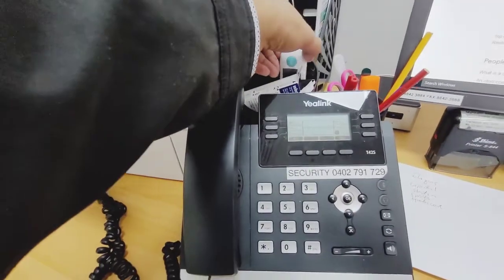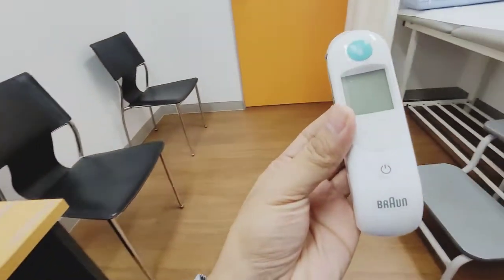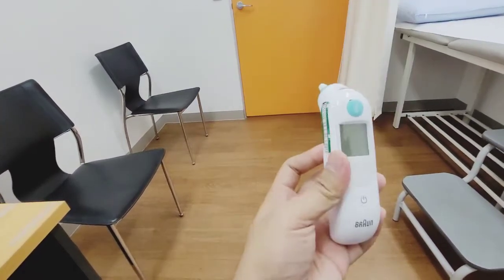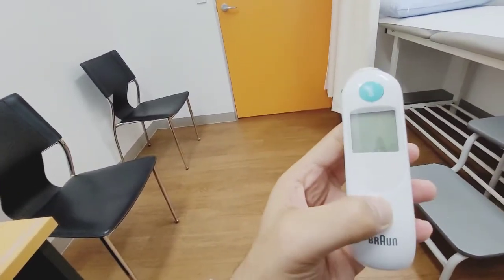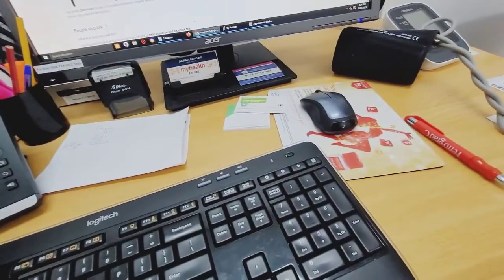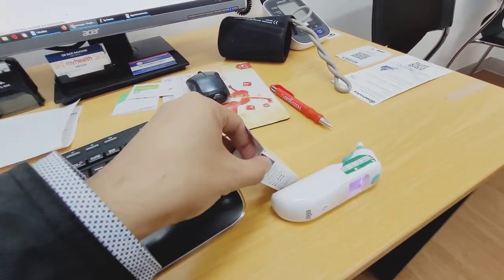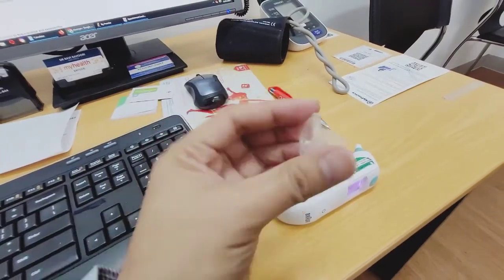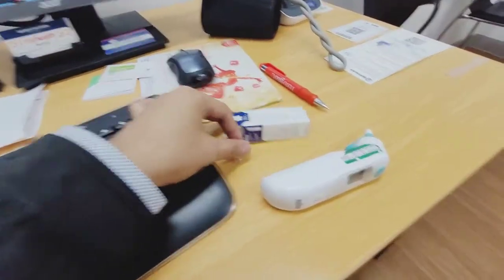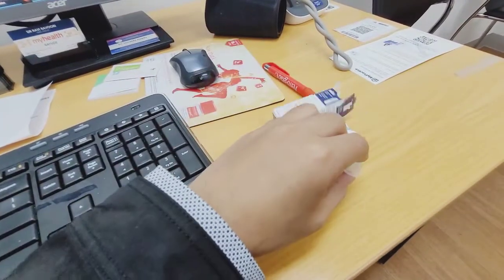And then I have here the tympanic. We call this tympanic because it checks temperature using the ear. That's why it's called tympanic. Before you use it, you attach one of these so that the machine will give you an accurate temperature reading. Attach it there, push this button, and the machine will give you the temperature.